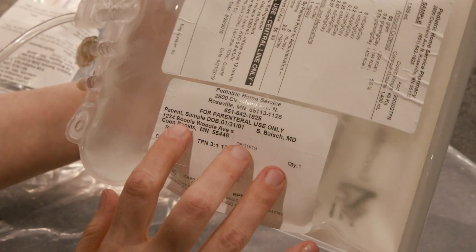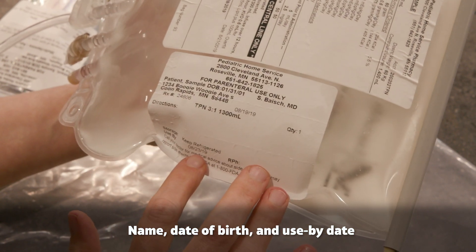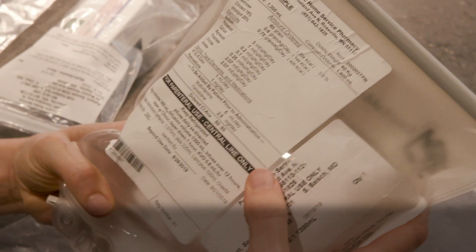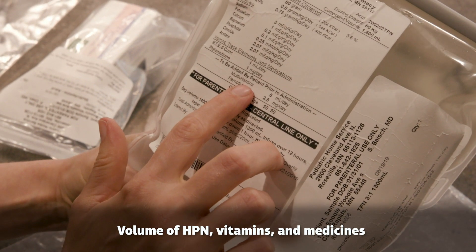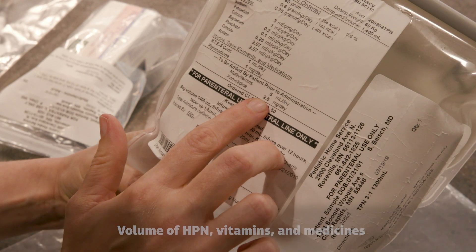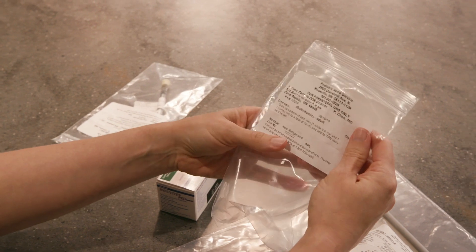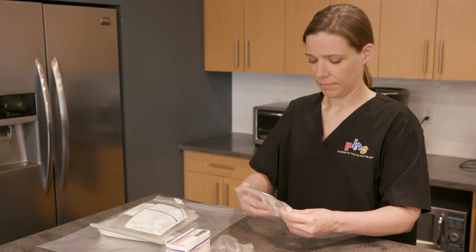Check the label on the HPN bag. Make sure the label information is correct, including the patient's name and date of birth. Verify the use-by date to make sure the bag is not expired. Check the amount of HPN, vitamins, and medicines you should give. Repeat this process to verify patient information and amounts to give for the vitamins and medicines sent by the pharmacy.